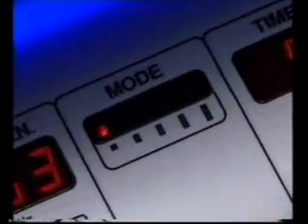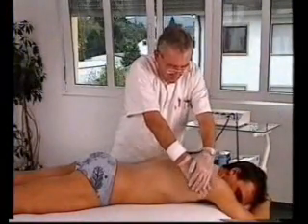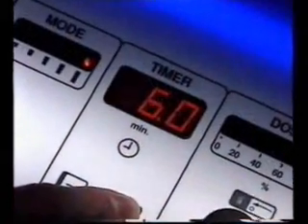The mode function alters the resonant vibration, which can be adjusted from slight to intense. This happens by varying the ratio of pulse time and interval time.